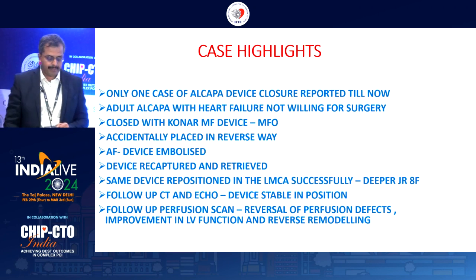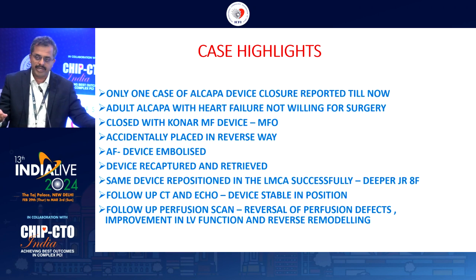So the intention of presenting this case is that till now only one case of such Alcapa device closure has been reported in literature. This was an adult person with Alcapa with refractory heart failure and just not willing for the standard of care, that is surgery. We closed it with the made in India Konar MFO device, from Nageshwar Rao's lab.